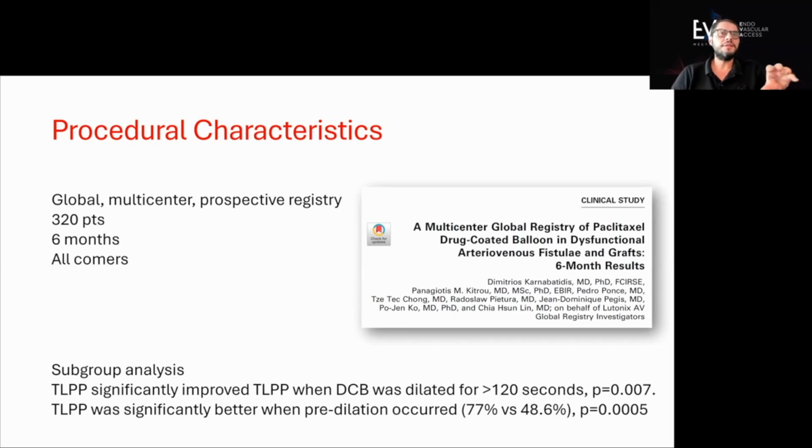So in the cases where no pre-dilation was performed, the results were worse. And the second thing is that when the drug-coated balloon was inflated for more than 120 seconds, meaning more than 2 minutes, the results were significantly better as well.